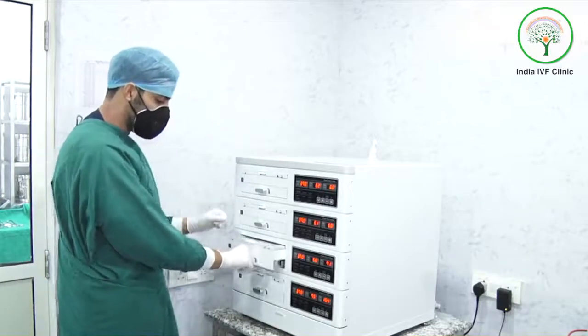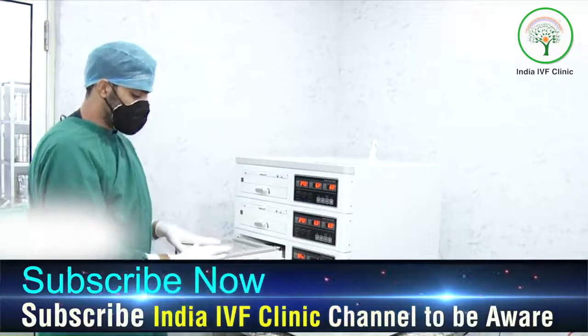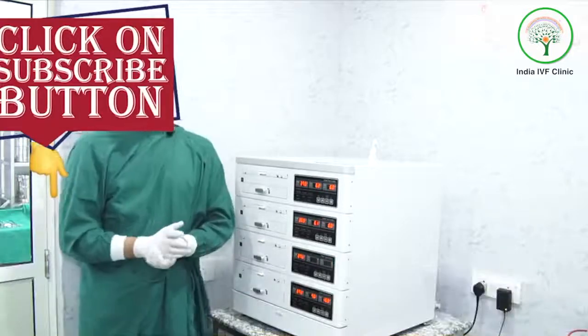If I open an incubator here, you can see there are three different dishes for three different patients. This particularly mimics the same environment as the mother's womb, and this is where we culture our embryos and grow them till day five.